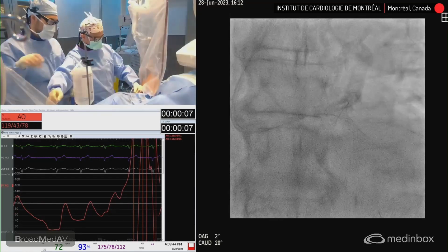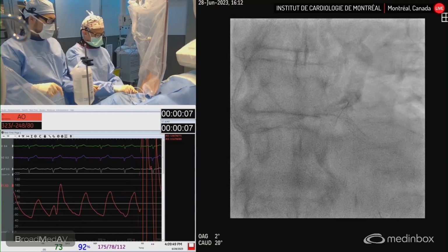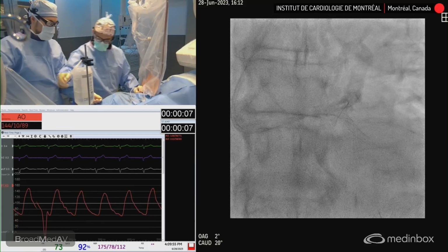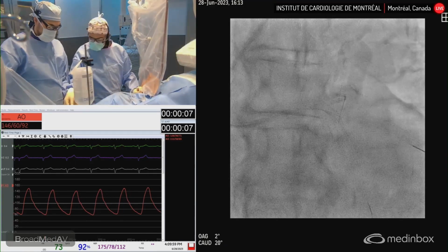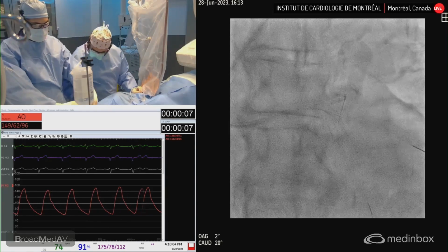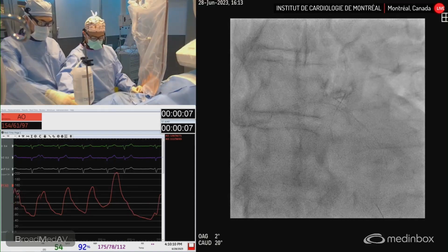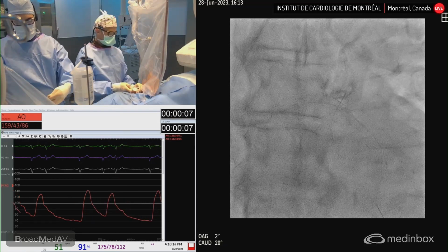We're just gonna remove both balloons. So you're gonna have the 5.0 that we had? Do the pot for the IVUS? Yeah. Okay, 5.0 by 8 that we had. Take out the wire in the marginal or not? Yeah, I think so. One wire too many. Yeah, we'll remove the wire in the marginal. I think it's the one. Yeah, this one. And remove the marginal wire. Good. And then we're just gonna go pot on the circumflex wire and then IVUS. Then we prepare the IVUS.